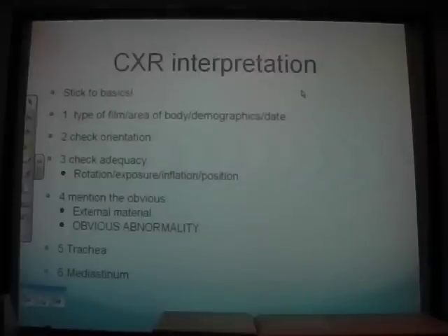Mediastinum, why is it really important to check the mediastinum? Two main things. And cardiomegaly. Yeah, what else? It's not going to kill you very quickly. Yeah, dissection can as well. And when your esophagus perforates, that's really bad, and that can cause a widened mediastinum.